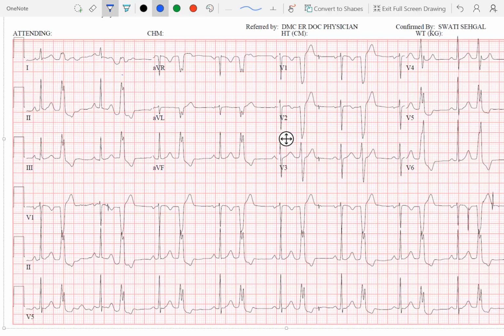Okay. So the significance of an early coupled PVC would be what? So the early coupled PVCs are PVCs that can sometimes put the patients into ventricular tachycardia, ventricular fibrillation. So the risk then is higher. Again, it's not one thing. If you just saw one PVC out of several that is early coupled, and all the others are late coupled, it probably doesn't mean anything. But if you see consistently very early coupled PVCs that are happening on the T waves, then you might be a little bit more worried. Got it. Again, that doesn't mean that the patient is going to have ventricular fibrillation, but that's probably a risk factor.